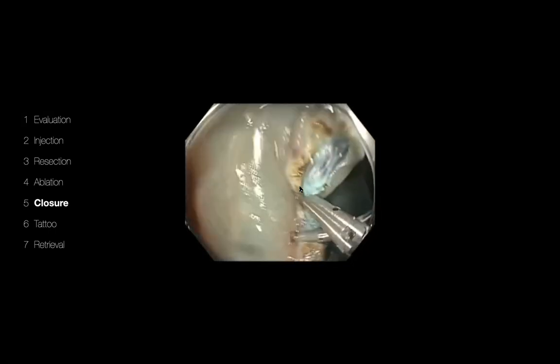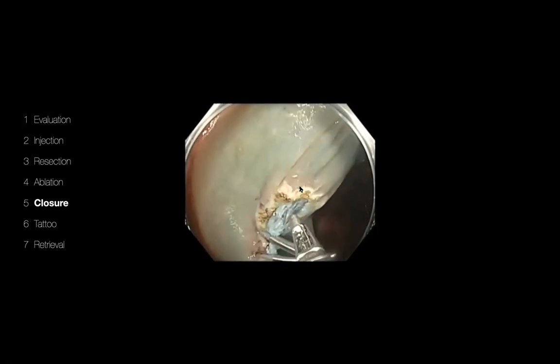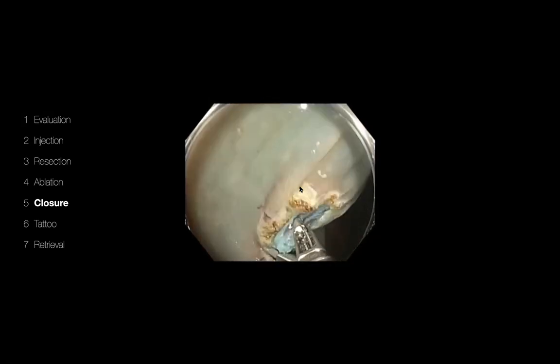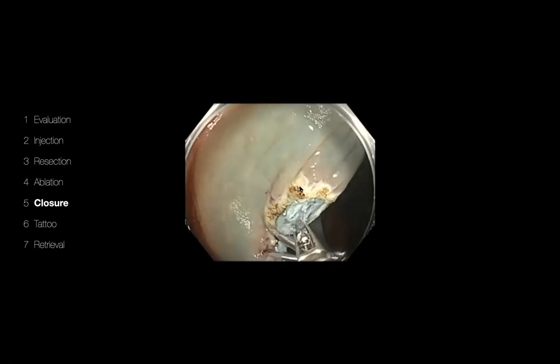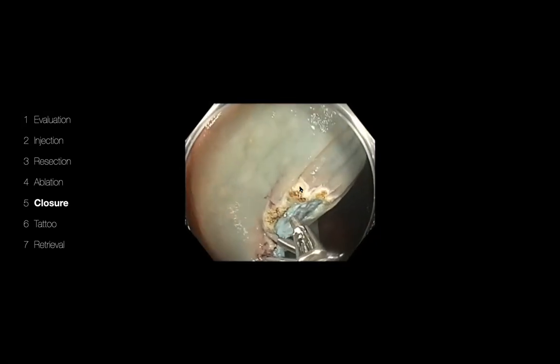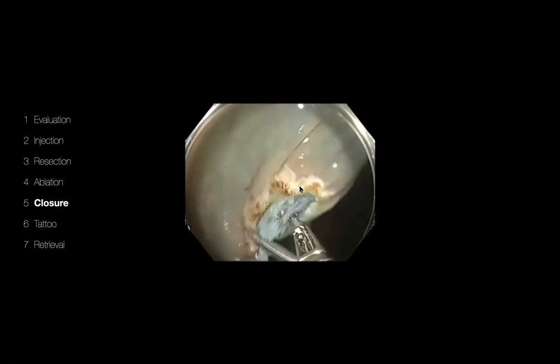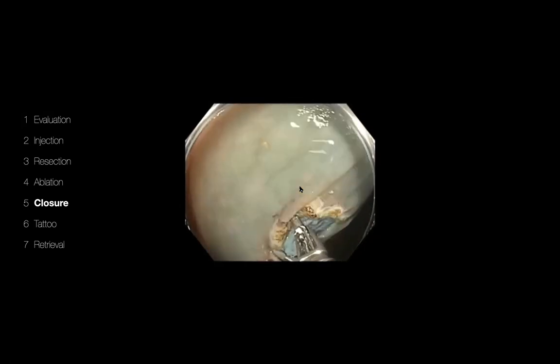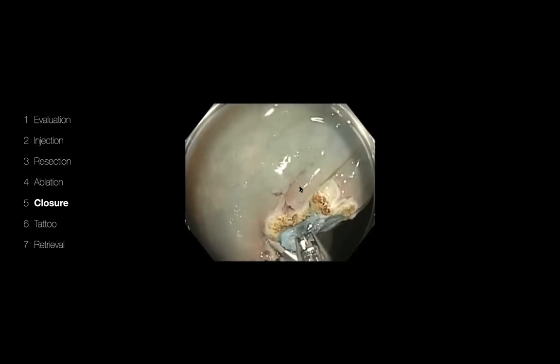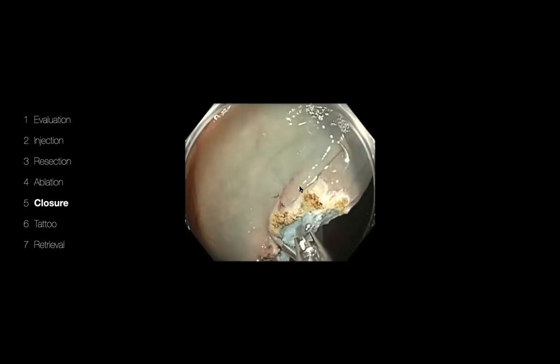And I used the principle of what Sriram talked about: look at the blood vessels and do soft coagulation. So it's very interesting. You will see that I'll be futzing here for a long time to do the soft coagulation. What happened was my machine was set at APC because we used APC before, and it was a little bit of a struggle to change from APC to soft coagulation.